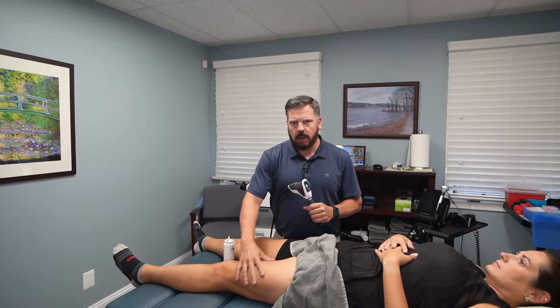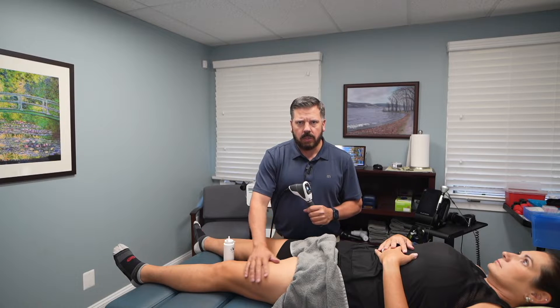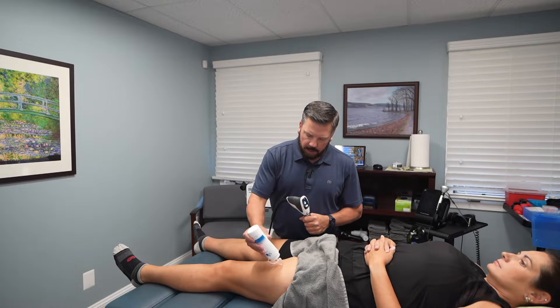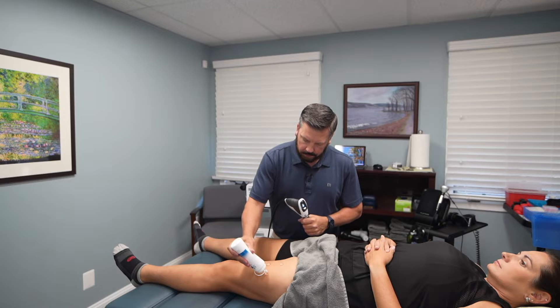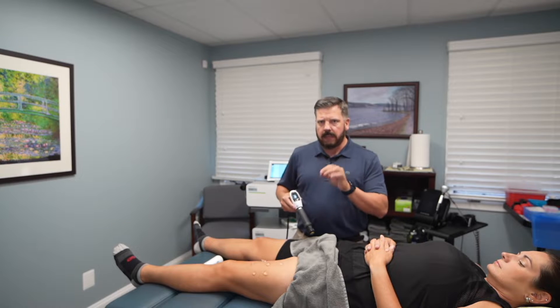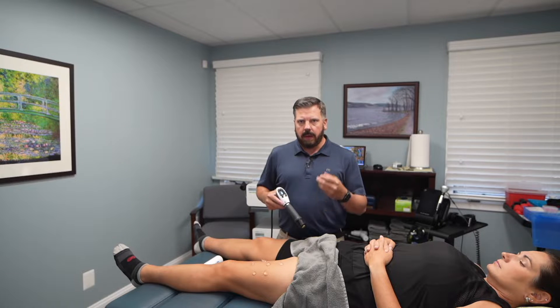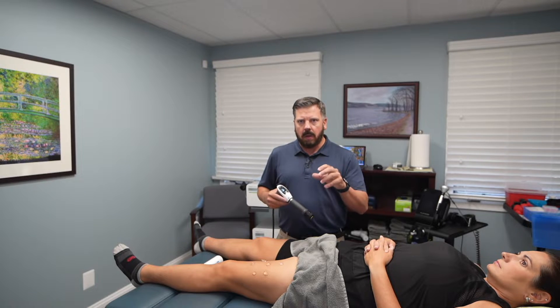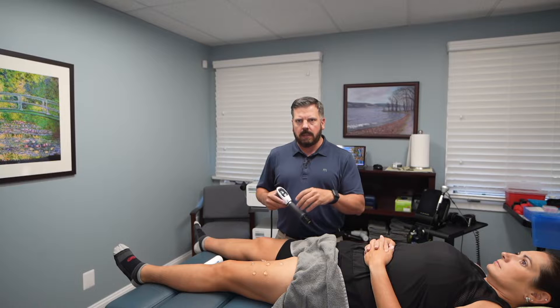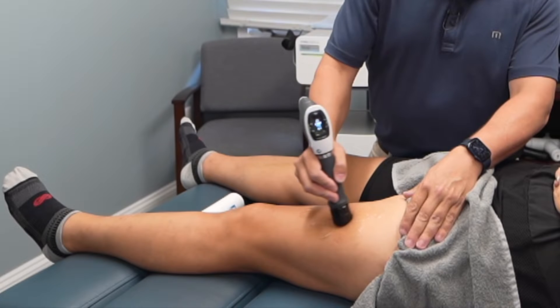We're going to apply it onto her quadriceps — say we're treating knee pain and she has tendonitis in her knee. I want to clear out any muscle issues in her quadriceps and any tightness in this area. I'm going to apply some ultrasound gel in the area I want to treat, then turn it on. You're going to hear a tapping sensation as we apply that projectile over the area, causing the sound wave to go into tissue. You may see the muscles start to twitch, and in slow motion you would see it creating a wave into the muscle.